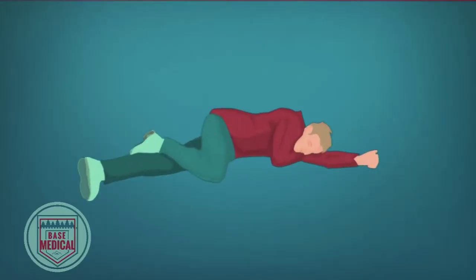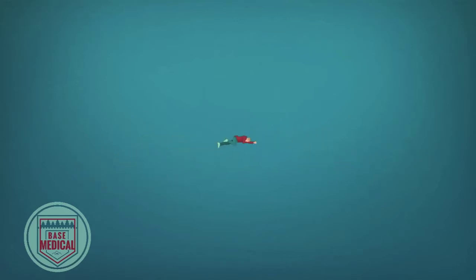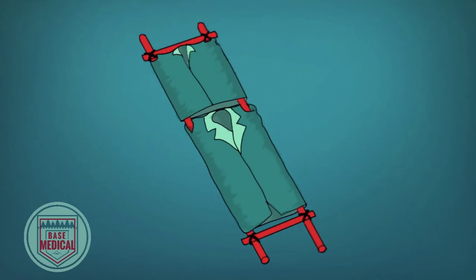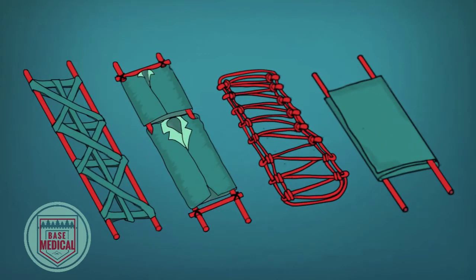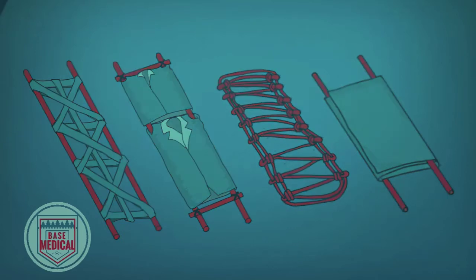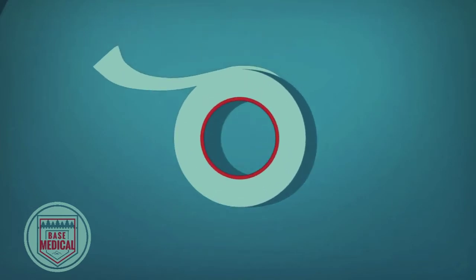Moving an injured person in the wilderness is not an easy or fast task. Knowing how to build a stretcher that will help carry a patient further and more efficiently is an extremely useful skill. Improvised stretchers can be difficult to make without prior knowledge or practice, and there are many different ways of making one. Today we will test, review, and show you how to make four different types of stretchers in the wilderness. Let's start with duct tape.